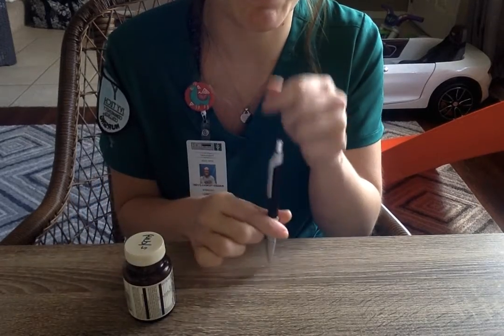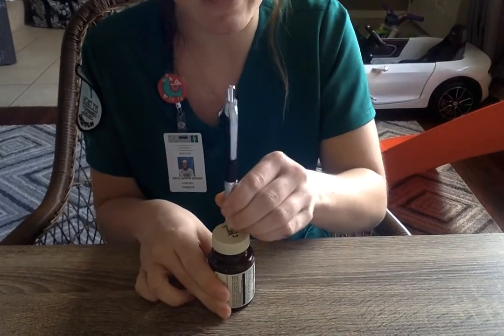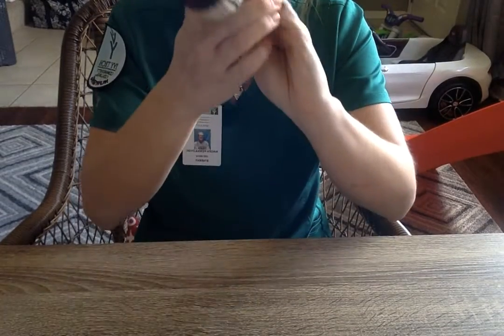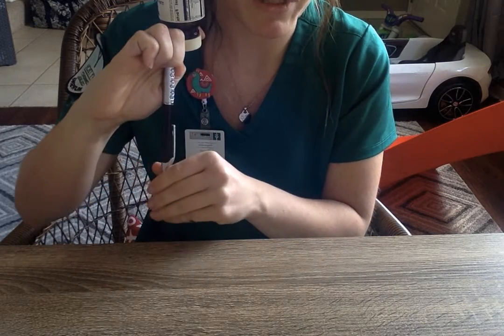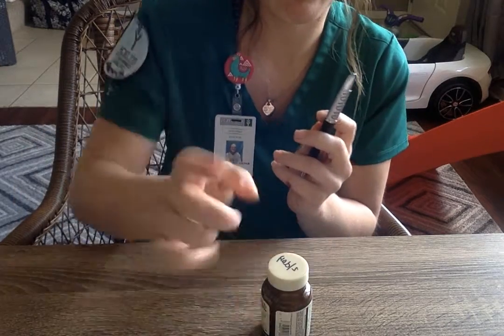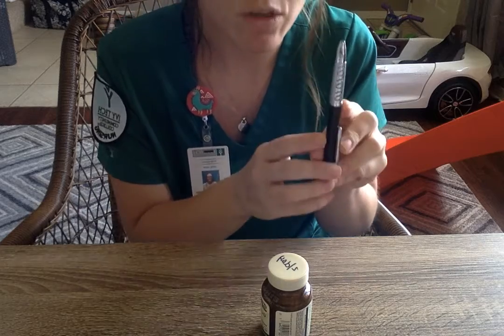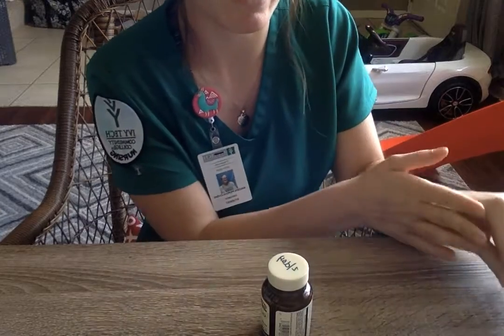So like I said, I'm going to pull back 6 units of air. I'm going to go ahead and dart it into the vial, push it. I'm going to push the 6 units of air into my vial. I'm going to flip it upside down like so, and then I'm going to pull back 6 units of insulin. Then I'm going to safely cap and label and date and make sure that I know that this is my Humalog, which is my subcutaneous, which is my insulin, and I have it ready to go next to me.